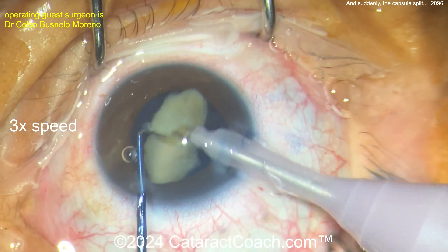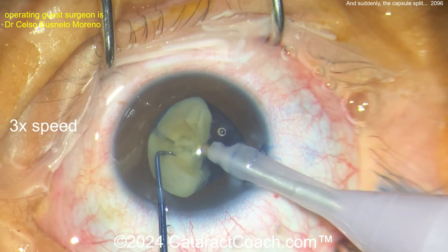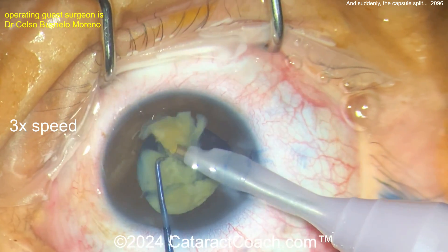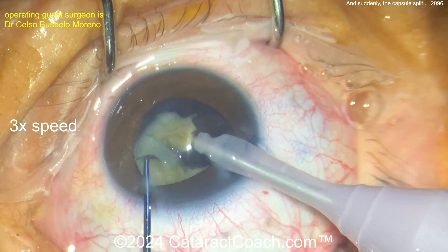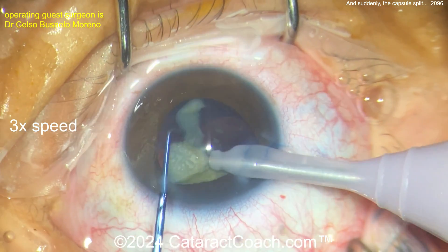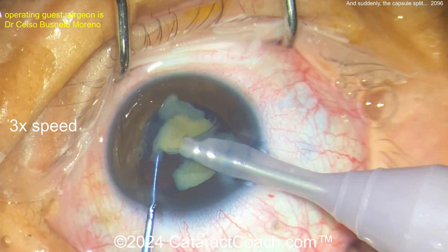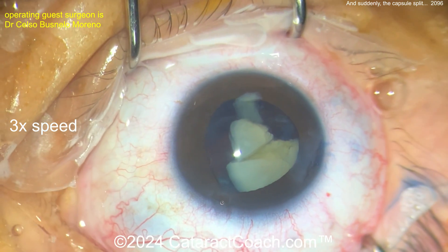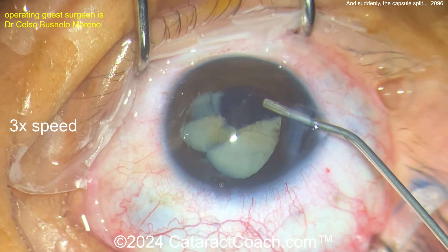Let's just start emulsifying. Luckily it's not too dense of a cataract — I don't see any brownness to it. It has good density but it's not that brunescent fibrous leathery kind of stuff, so this should come down pretty easily. The nucleus removal is going to be the easy part. I'd caution you against too much chopping — just keep all the pieces together, apply the energy. At this point you're really not worried about how much phaco energy you're putting in; it's not going to be a big amount anyway. Energy, energy, energy.